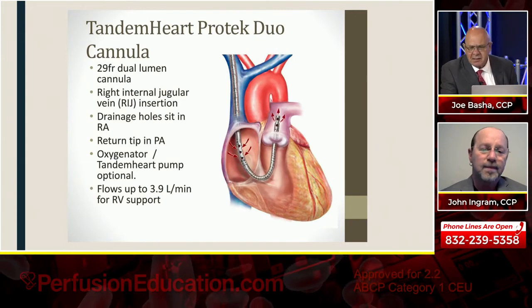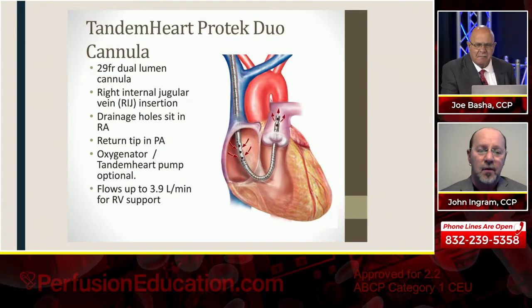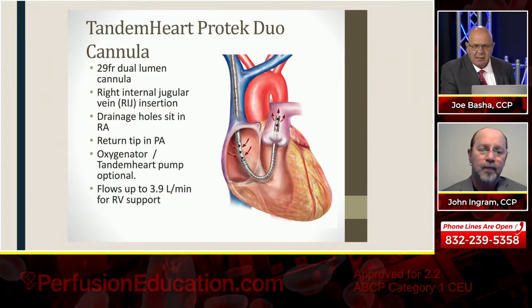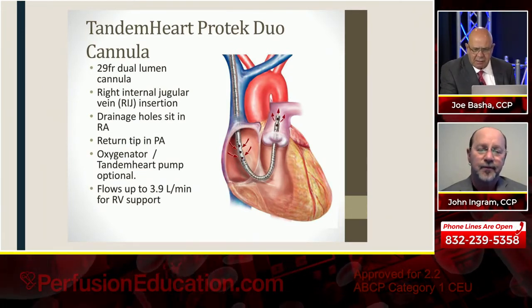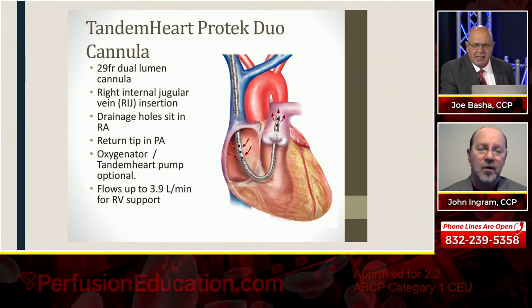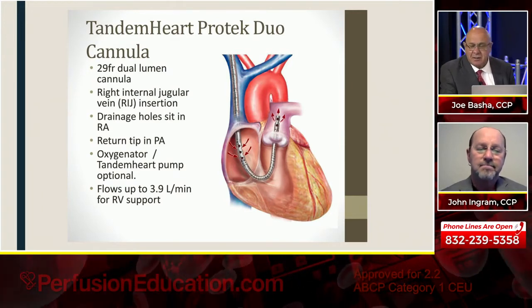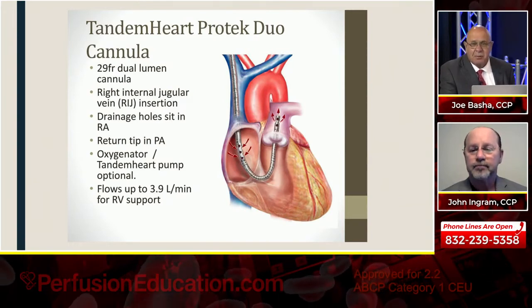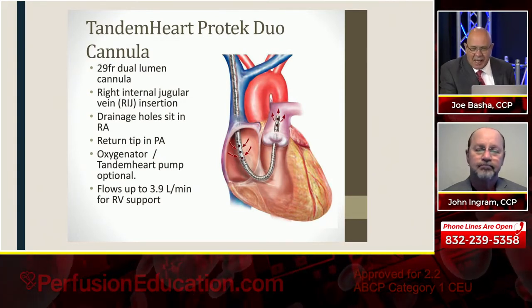And that's where you get into the exotic cannulations you're going to talk about tomorrow, VV ECMO or VVA ECMO. And I think you can also treat that hyperdynamic state and actually work towards reducing their cardiac output to try and get some oxygenated blood to the tissue. But of course, if they have vasoplegia, in fact, Dr. Simpkins is going to be giving a talk on treating vasoplegic syndrome, and they have a very good solution to that.